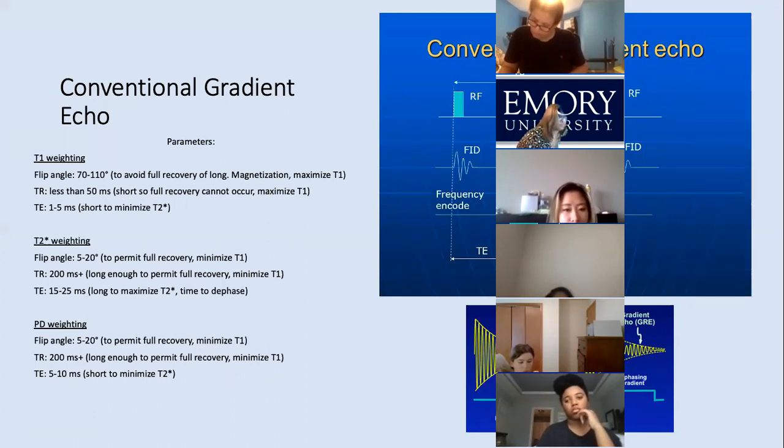So unless you drastically change your flip angle, you're not going to see a change in your image weighting. But that would be the last option, or no, changing your slice number would be the last option. It would be the second to last option I would do. I would always go first to your TR, change your TR, but make sure it's still within your range. If it's not, I would open that protocol back up and bump up your concatenations to 2 so that you can get more slices within a TR.